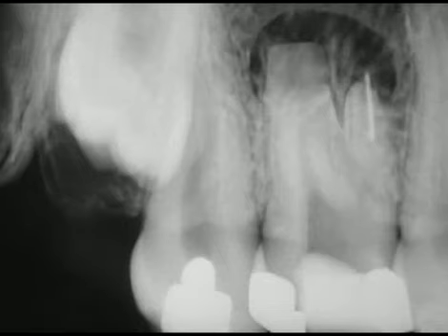Here's a challenging case. A distal oblique angled preoperative film of a previously endodontically treated and surgerized first molar. Note the previous access. A broken instrument off-centered in the root. Apisected roots and a possible MB2 system.